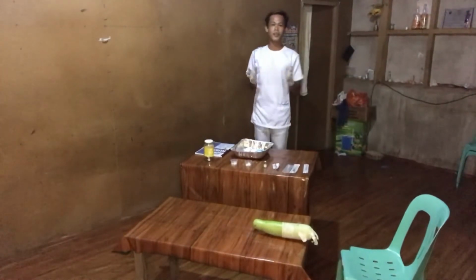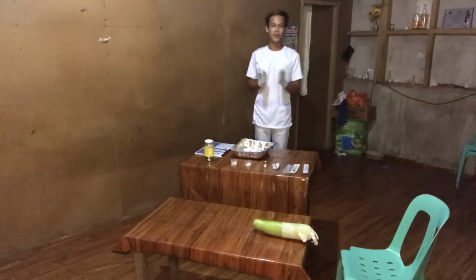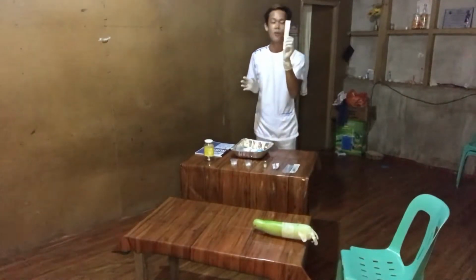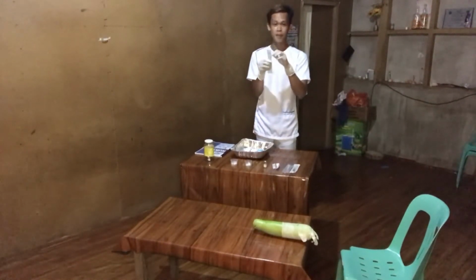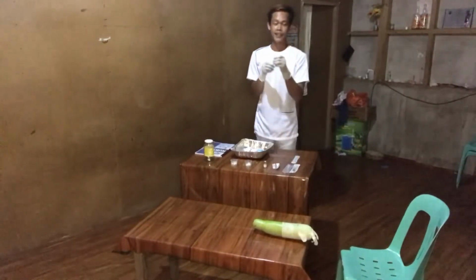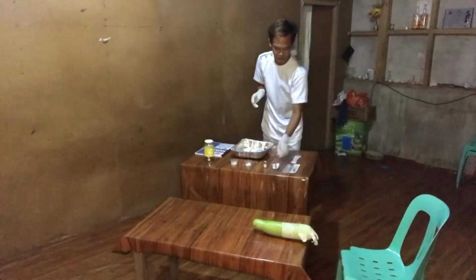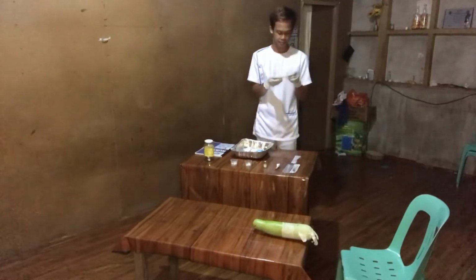To prepare the medication for an intradermal injection, first we need to get the tuberculin syringe. This one is a tuberculin syringe. The next thing that we're going to do is open this sterile package, and at the same time open the aspirating needles.